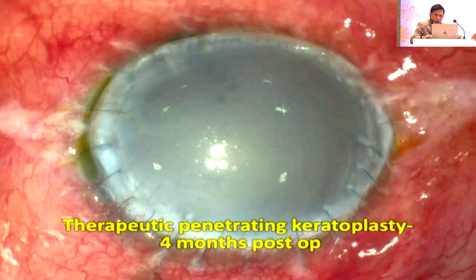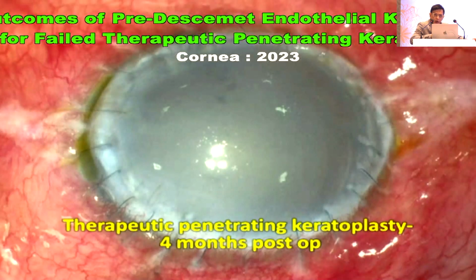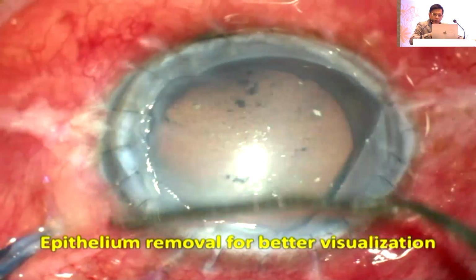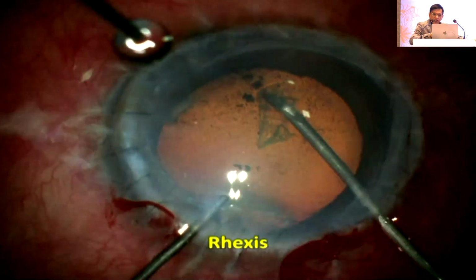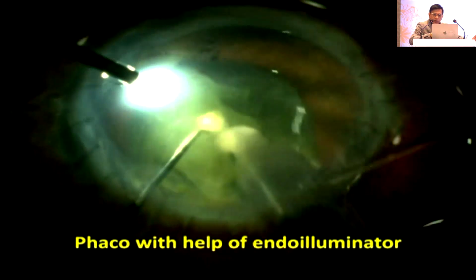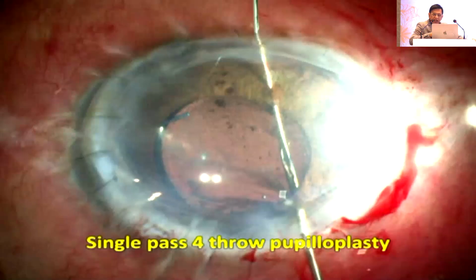Wait for 4 months. Don't worry, it will fail. Don't worry, let it fail. Okay, we published this in Cornea also. Once it has failed, now what I'm going to do is a phaco in this. So you have a very bad corneal ulcer, not manageable by medical treatment. You have done a penetrating keratoplasty. Wait for some time. Let it fail. Now after 4 months, I've done the phaco.